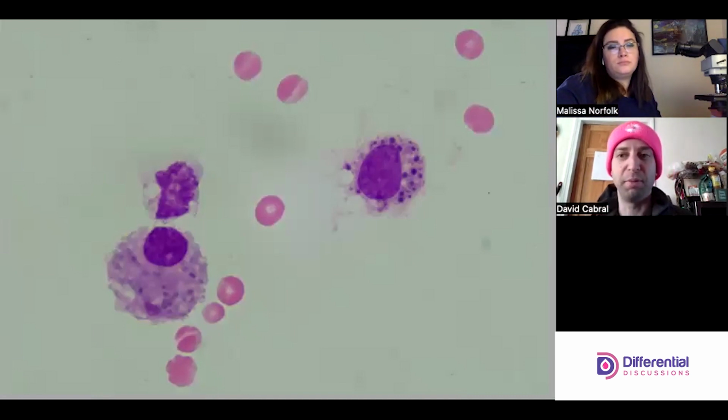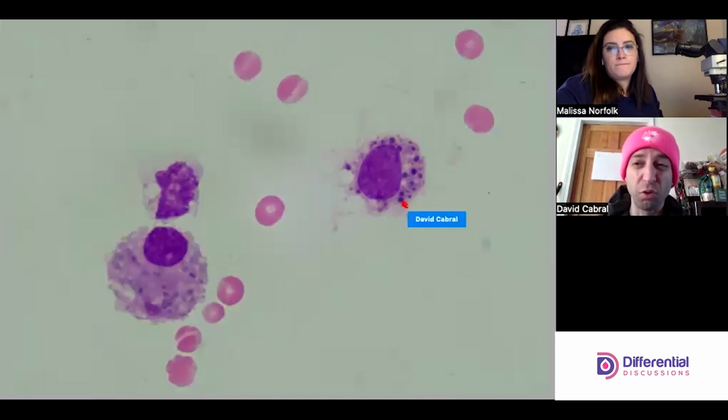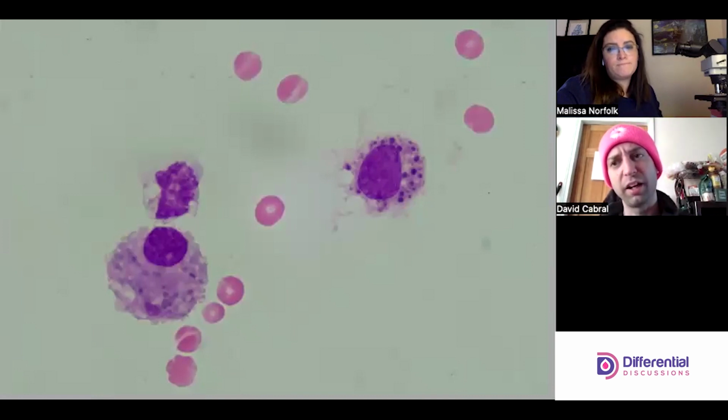That to me makes it much less likely to be some kind of organism. Not unreasonable to see colored staining like this with ovoid and circle forms for yeast, but generally there'll be uniformity, right? So I think this is more likely a blue-black kind of granule. What do you think? Agreed.